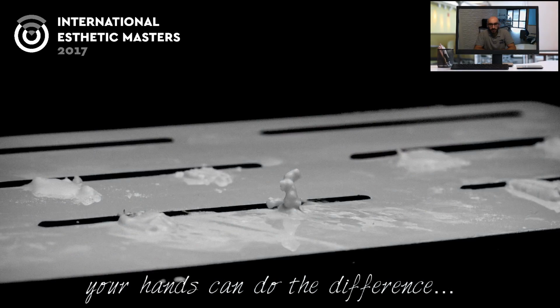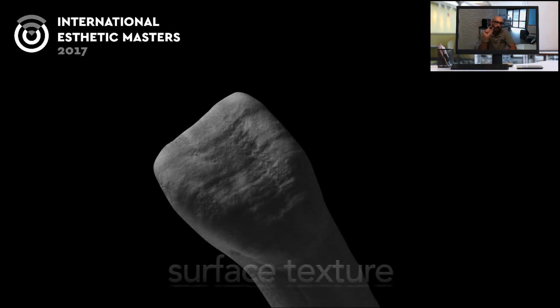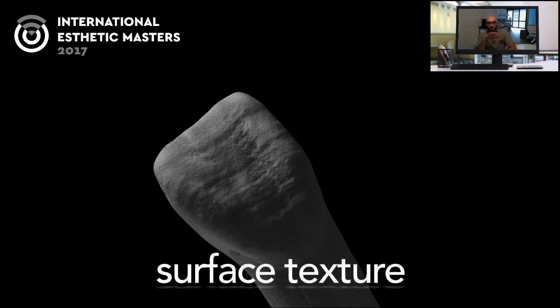Your hands can make the difference. Your hands are still working well, I think. Because what we miss today with this CAD/CAM technology, in my opinion, is two small but very important things. One is the surface texture, because all monolithic materials are not so easy to work with to get a very good and natural surface. I don't want to say that this is impossible. We are also working on it. We try to make something better every time. But the surface texture with this very strong material is not so easy to get. So we have to keep this on the handmade side.